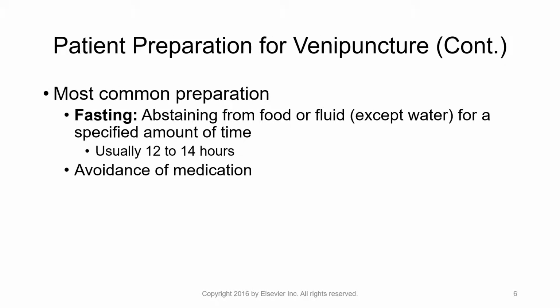Patient preparations for venipuncture. The most common patient preparation is fasting. Not all laboratory tests require fasts. A fast is just defined as abstaining from food or fluid except for clear liquid water for a certain amount of time. Somewhere at least 6 to 8 hours, more commonly 12 to 14 hours. That's the most common one.